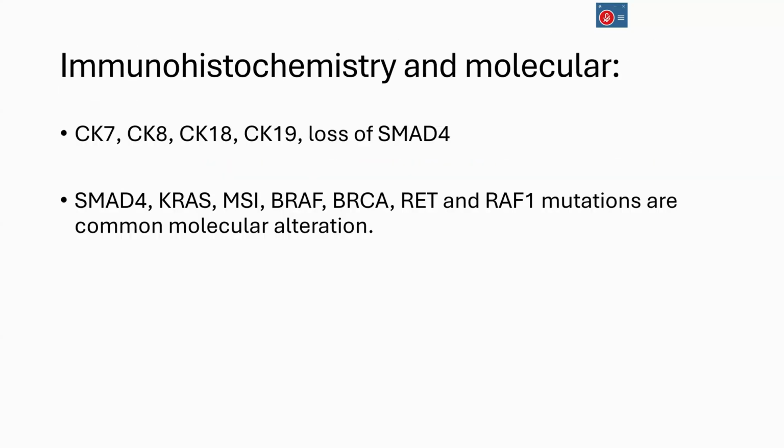And it's very important. Previously, when EUS-FNA was introduced in the 90s, it started only with FNA, like smear slides only. Later on, gastroenterologists and the GI team moved to taking a biopsy as well, along with the smears. And now the current practice is that most of the advanced center labs put everything into a cell block and in formalin to preserve each and every cell, considering the importance of molecular studies, because for molecular studies we need tissue.